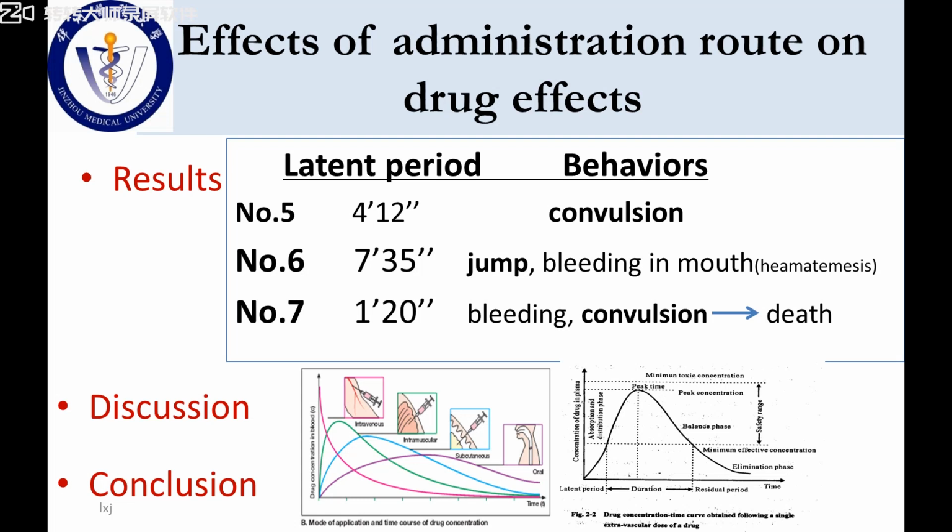The drug effect takes onset relatively early and faster. But secondary is subcutaneous injection. Intragastric administration is the slowest and mildest. Okay.